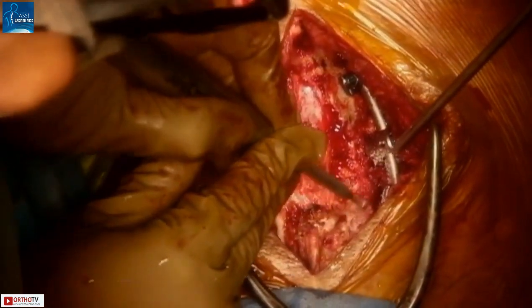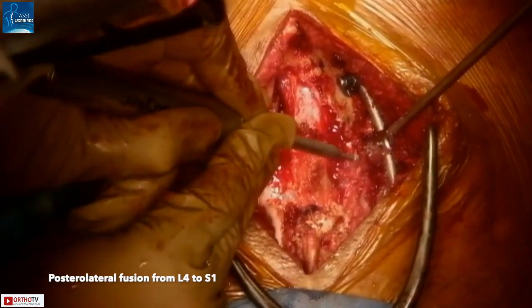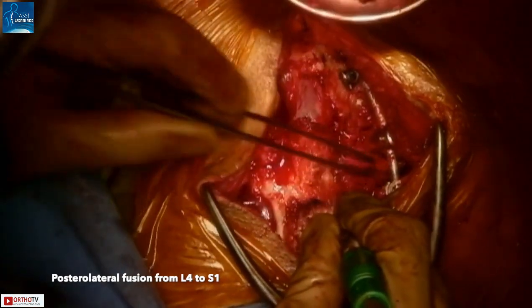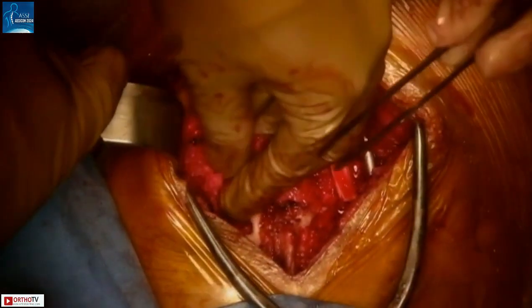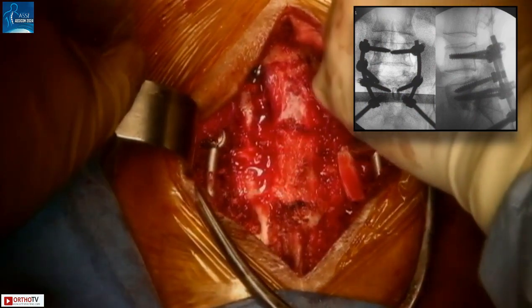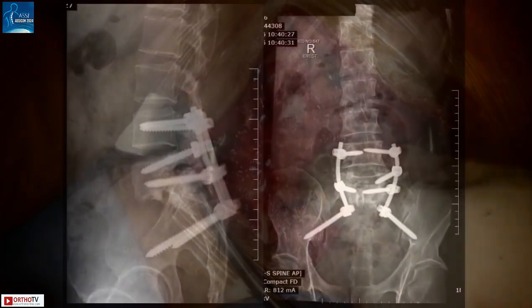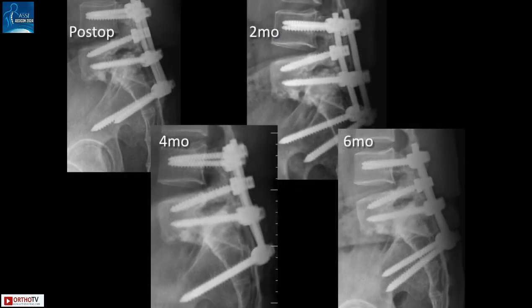Posterolateral bony elements are decorticated from L4 down to S1 for posterolateral fusion. A mixture of locally harvested autograft and allograft is placed over the decorticated surfaces. Final intraoperative X-rays before closure show good alignment and accurate placement of implants. These are his immediate standing postoperative X-rays, and he went on to fuse quite well — by 6 months, he had solid fusion at L5-S1.